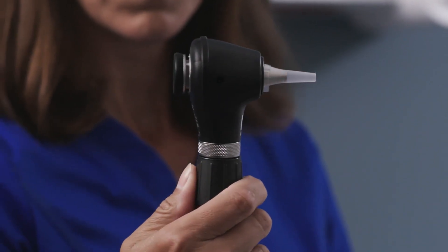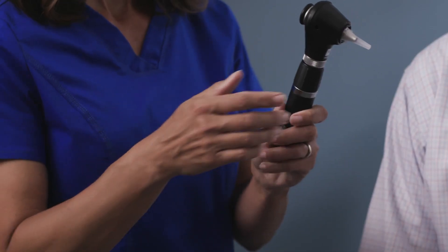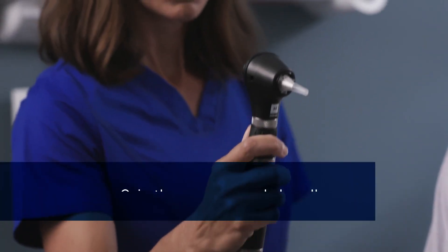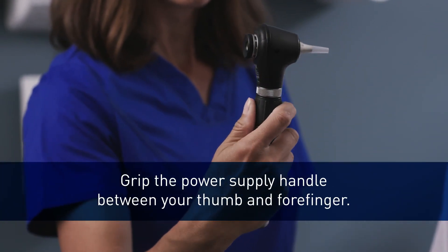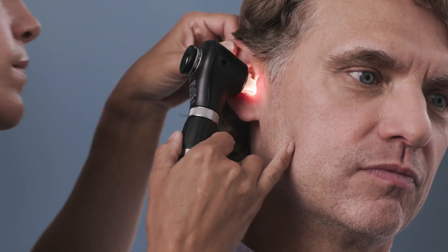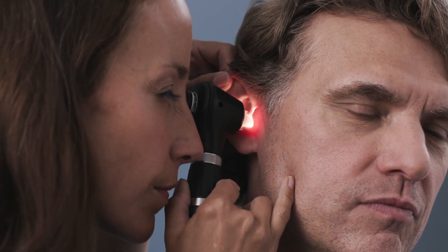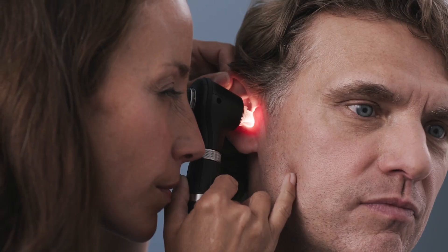There are two common ways to hold the otoscope and it's all a matter of preference. Some clinicians choose to hold the otoscope like a hammer, gripping the power supply handle between your thumb and forefinger close to the light source. Use your pinky and ring finger to help brace against the patient. With this technique, if the patient turns or moves, your hand can move with the patient's head to help prevent injury.